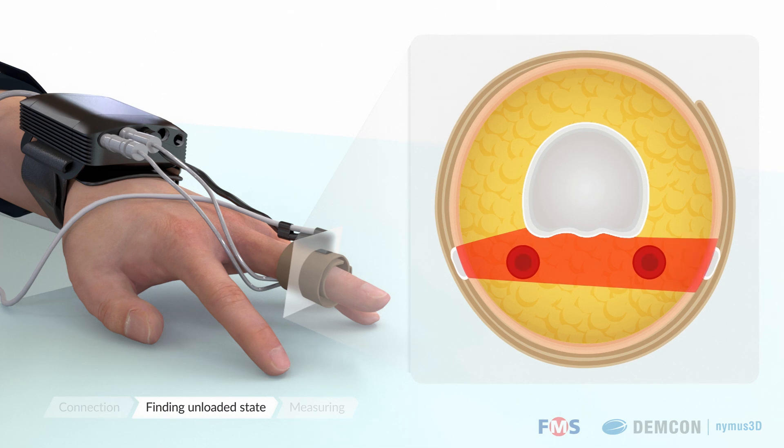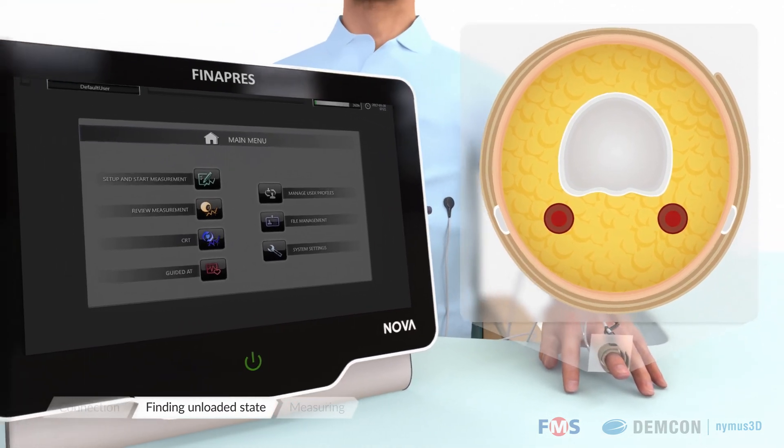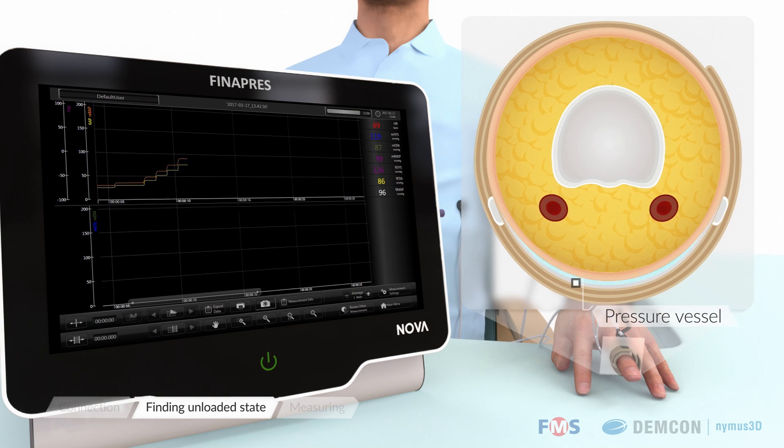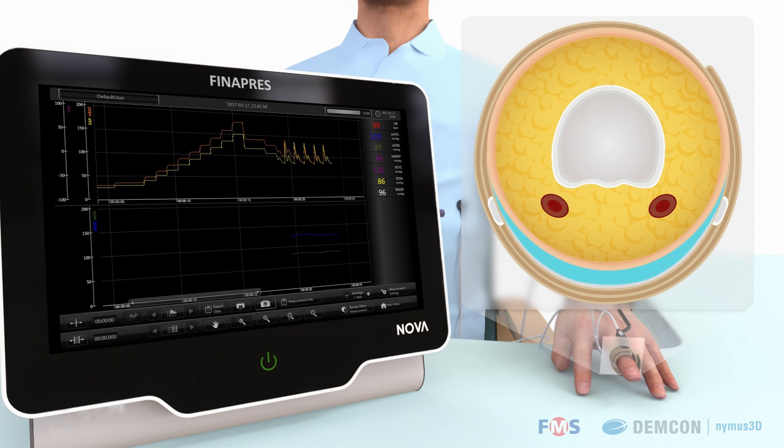Initially, it will assess the artery to determine its unloaded state. Subsequently, the nano-core module will start measuring blood pressure using the physiological algorithm. The nano-core processes the feedback from the light sensor and dynamically controls the pressure inside the finger cuff to keep the diameter of the arteries unchanged at an unloaded state.